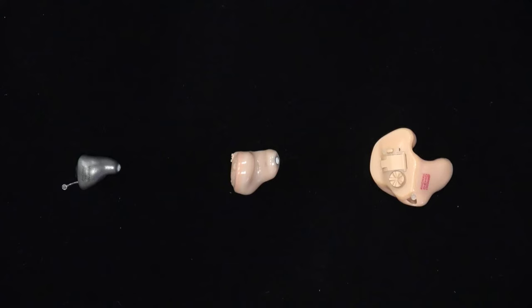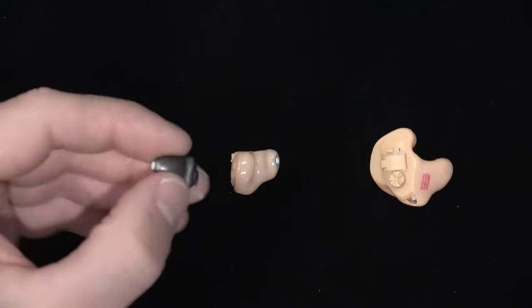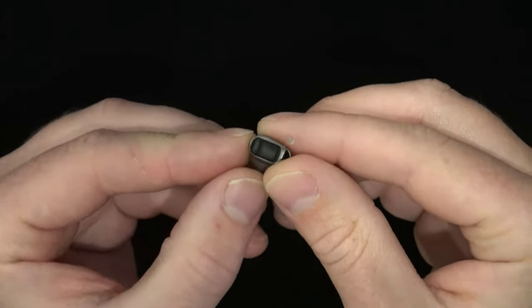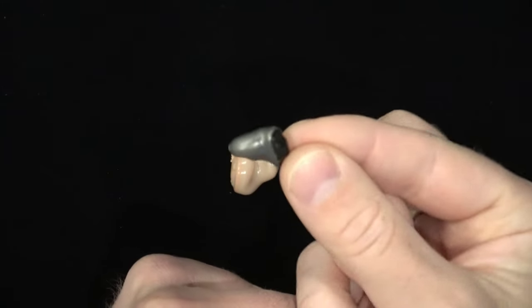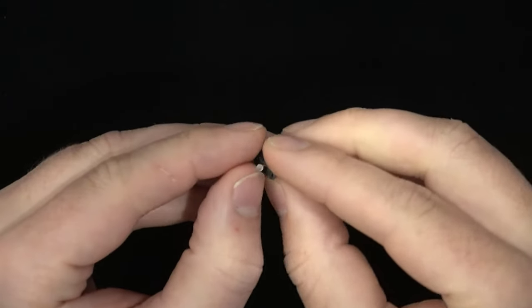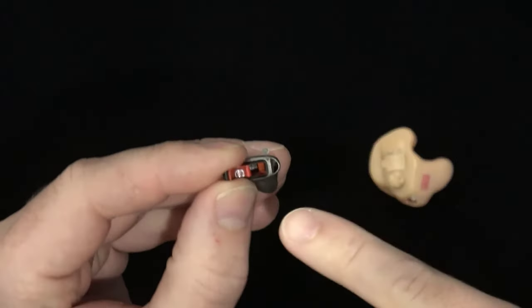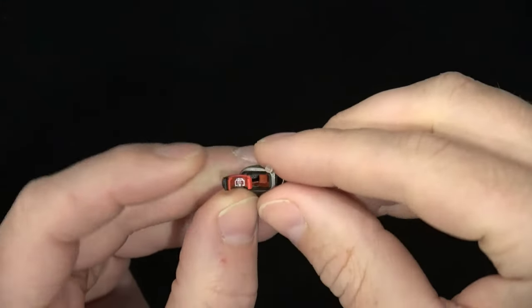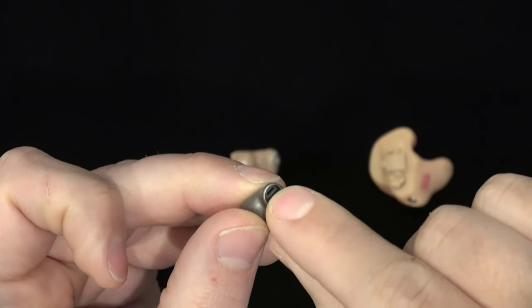Now here we have examples of custom in-the-ear hearing aids, and these can have a variety of different microphone configurations depending on the size of the device and the hearing aid manufacturer. Oftentimes for the smallest of these devices, there will only be one microphone and one mic port. For this invisible-in-the-canal device, the microphone is actually housed inside the battery compartment, and the port that leads to the microphone is actually this small opening near the hinge of the battery door.